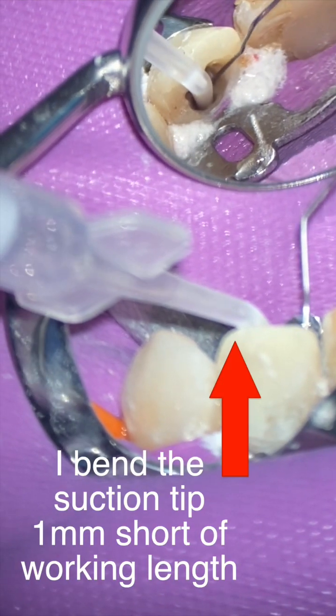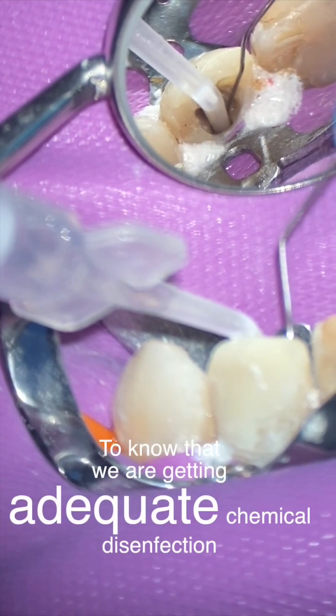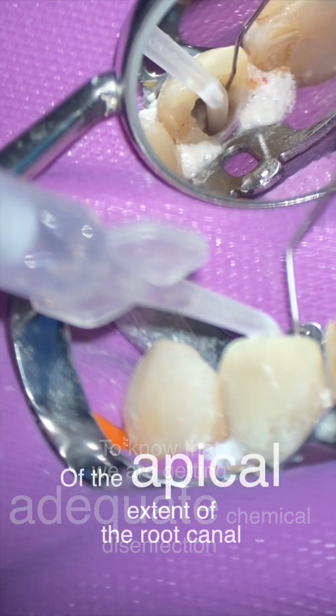So I'll bend my suction tip to exactly one millimeter short of my working length, and that way I know I'm getting adequate chemical disinfection of that apical extent of the root canal.